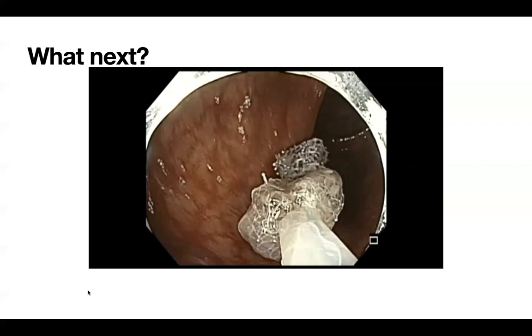I'm glad that you brought it up. A polyp like this, if I used an adult scope, I try to suction and come out. Usually it comes through the channel. The second one is when you use a pediatric scope, they tend to be very difficult to suction. You get stuck there.